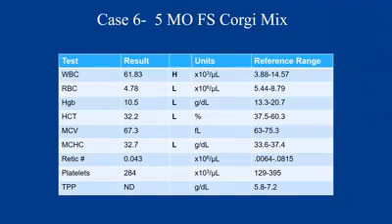So we got a CBC on this patient. The patient has a marked increase in white blood cells, so 61,000 white cells, which is a lot. Anything over 50,000 is usually considered marked, all right? The patient had a kind of mild anemia. This is not a 5-month-old puppy reference interval, but by 5 to 6 months of age, they should have about a normal red cell count. So we are anemic here, all right, non-regenerative, and our platelets were within reference interval. We did not get a total plasma protein, so this ND stands for no data, okay?